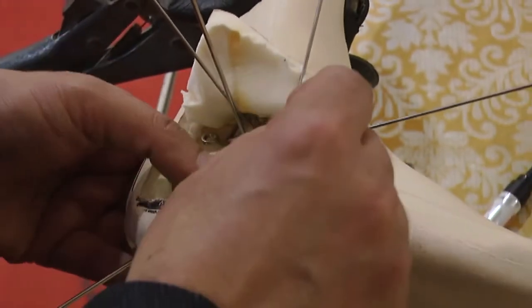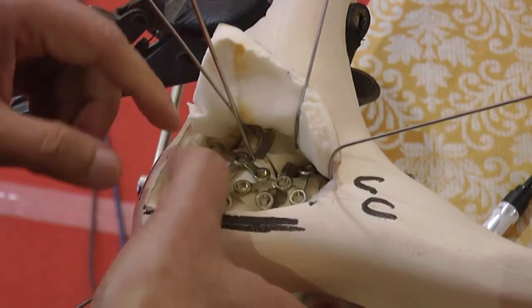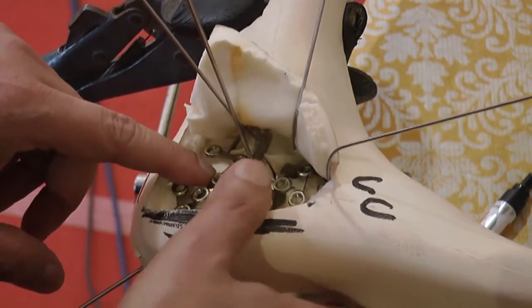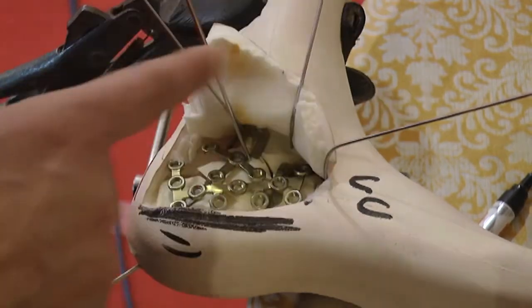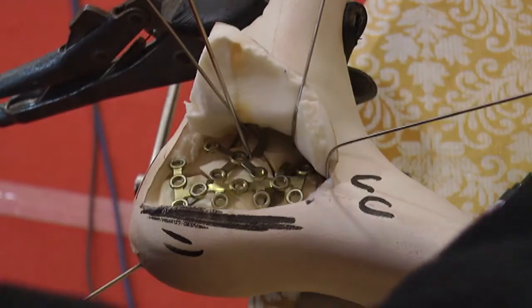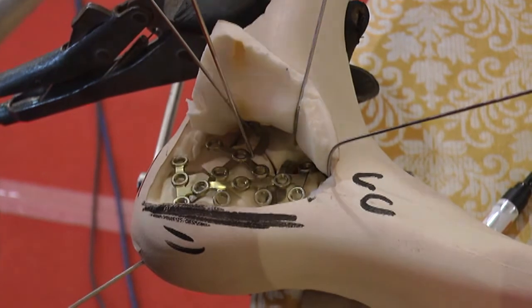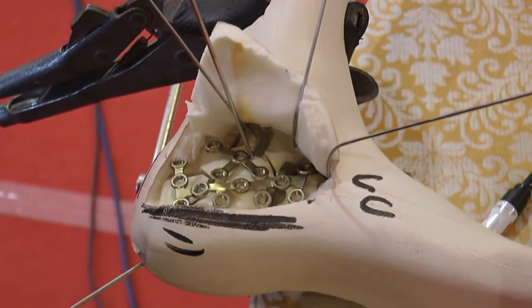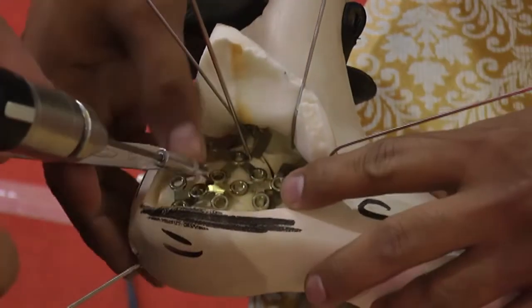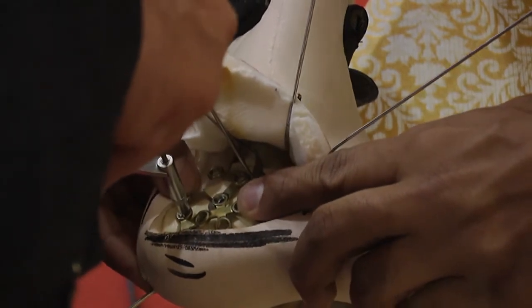Generally, when you put that plate, I first put a 3.5 cortical screw, so we have a 2.5 drill bit, into the tuberosity. The first screw that I put is into the tuberosity to stabilize the plate. Now, this wire is stabilizing the lateral facet, fixing it temporarily. You can choose to put one screw alongside the wire just to hold the sustentacular fragment rigidly from this side, provisionally. Can you stabilize the plate for me? Thank you. So first screw is into the tuberosity.